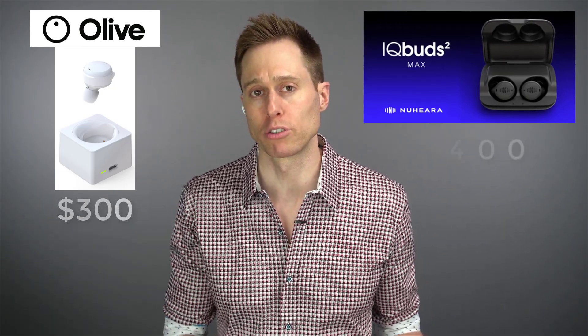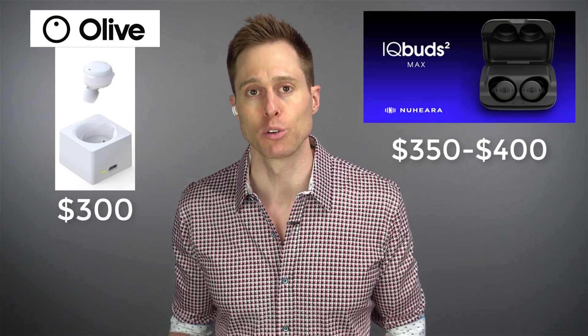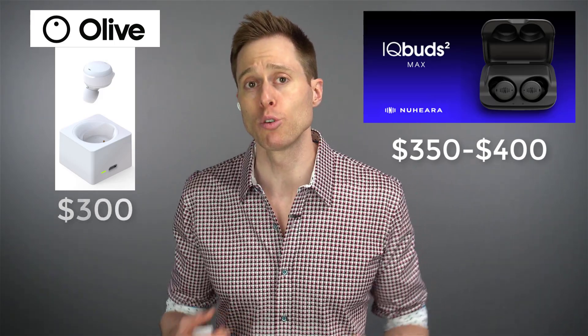As of the recording of this video, the Olive Smart Ear retails for around $300. Compare that to other hearable companies like Nuheara, which has the IQ Buds Squared Max retailing between $350 and $400, but that's for two devices — one for each ear — and it also comes with a rechargeable case you can charge on the go.